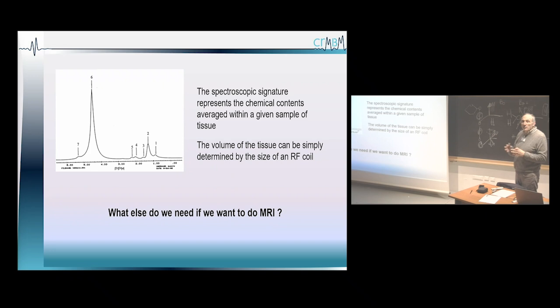You remember an image I showed you before. It doesn't look like a spectrum in here. In an image, you need to know, for instance, in the image of the thigh, that the bone is in the middle, or the fat is around. And in this spectrum in here, I don't have this information about where the water is. Is it in the middle, or is it around the tissue I am scanning? So we don't have this information. This is something which is missing, and this is something which we need if you want to do imaging.